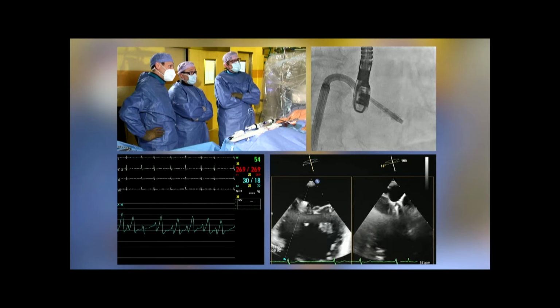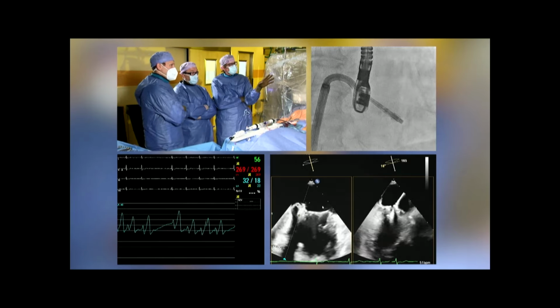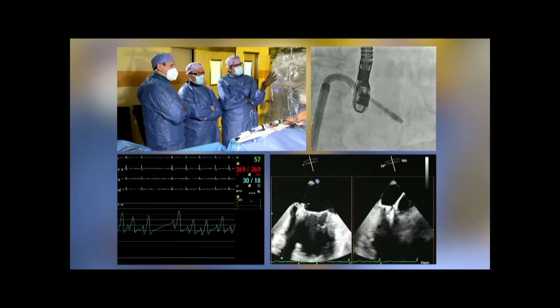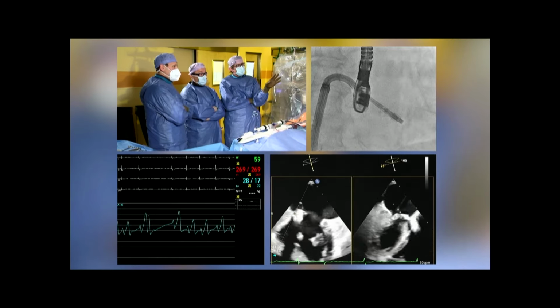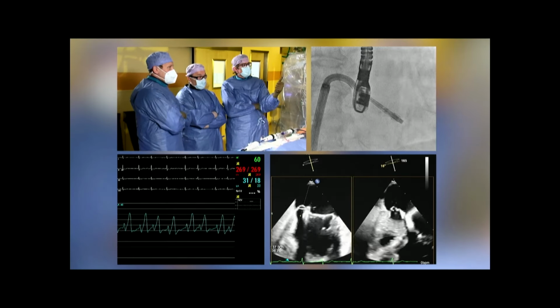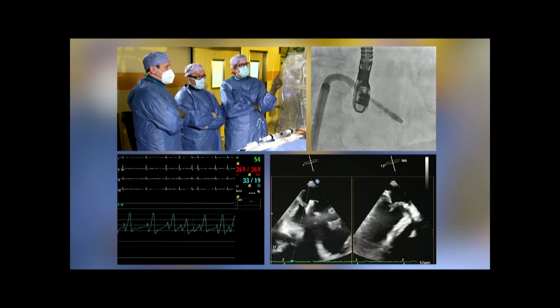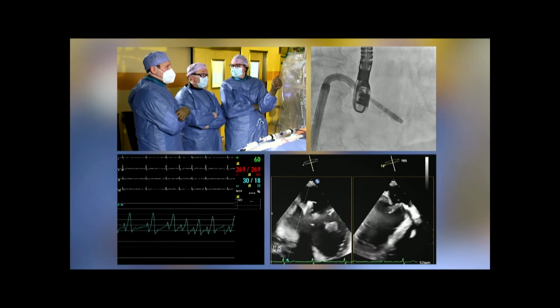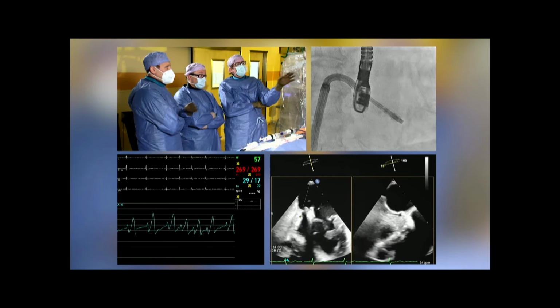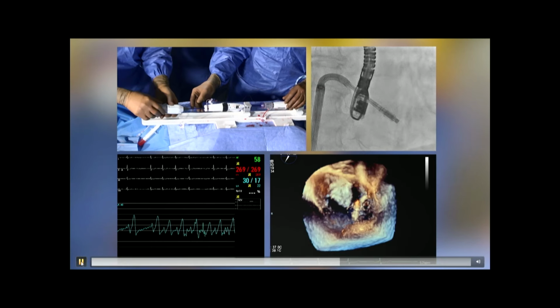So it's all perfect now, but I think we also have to respect the anatomy and what we are seeing. So we see still some prolapse left medially, and I think it will be more stable if we go medially and then place another one next to it laterally. You agree? There's no pathology lateral to it. So a bit of MR though. Yeah. Okay, then we open the device.